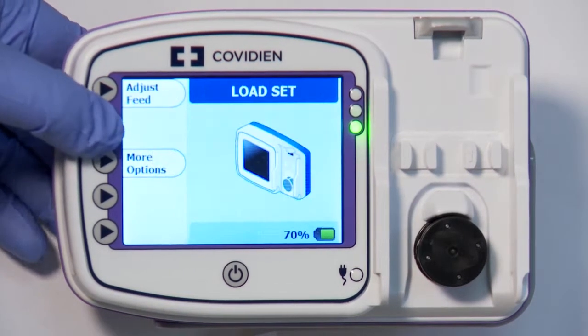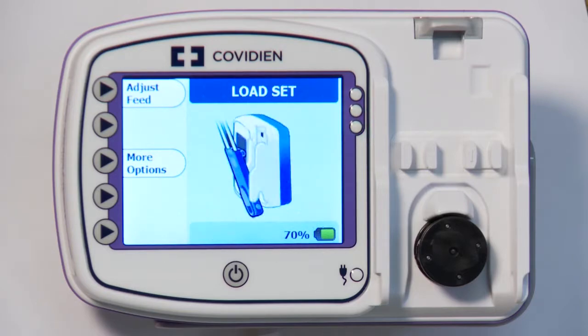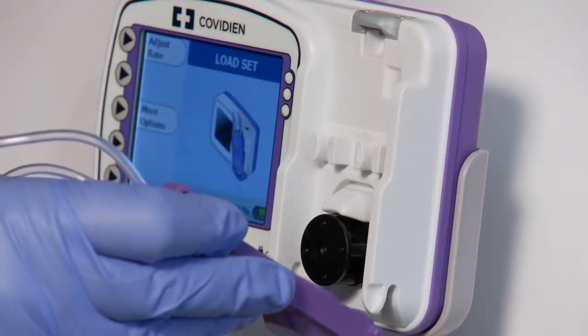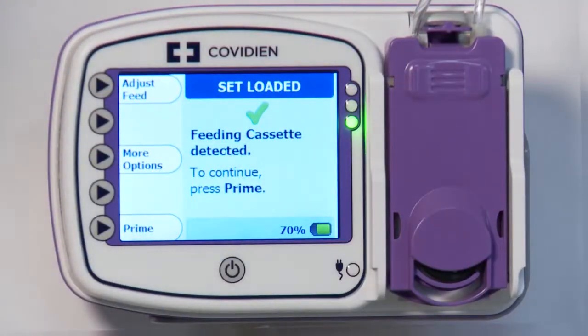Otherwise, press Clear Settings. Next, you will see the Load Set screen. Follow the animated instructions on the screen, sliding the bottom pegs of the cassette up into the slots, then locking the top into place. The set loaded screen will confirm that the pump has correctly identified the feeding set.